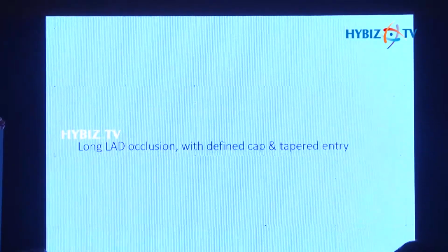The Stingray Balloon is a balloon that's shaped like a stingray. It's been around for 2 years, so I assume a lot of you have seen it. So you have 3 ports. You have a distal port, mid port, and a proximal port. The distal port essentially just continues. The proximal and the mid are 180 degrees apart, and then one will go towards the lumen like this, and the other port will go towards the adventitia. Stingray, so for those that are interested.